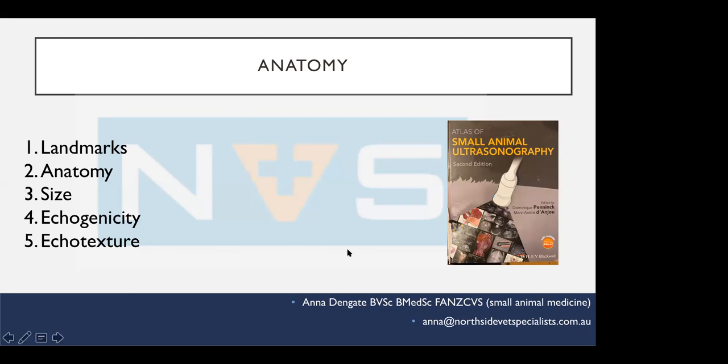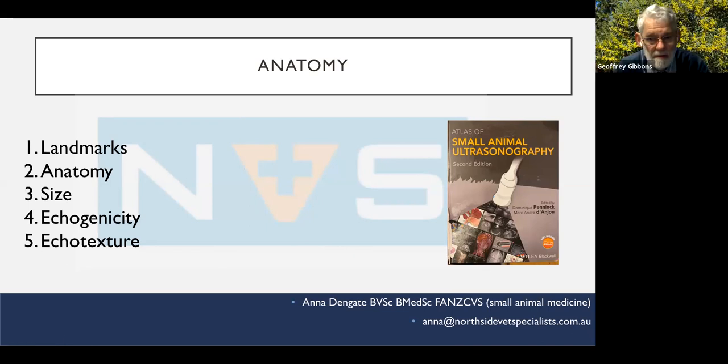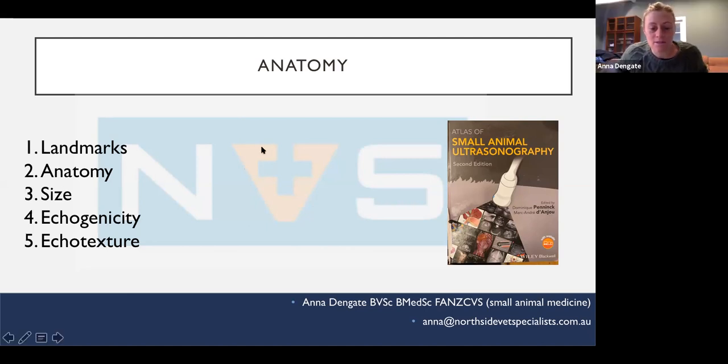So you don't get confused in the images. If it's pointing backwards, I move the wrong way and I get all confused. So you can't really make a definitive or objective assessment of size of the liver on ultrasound, but you can be pretty sure in some cases, particularly when there's moderate or marked hepatomegaly.